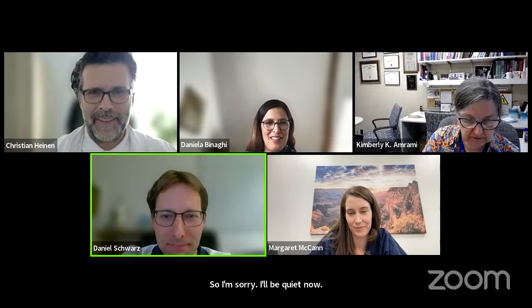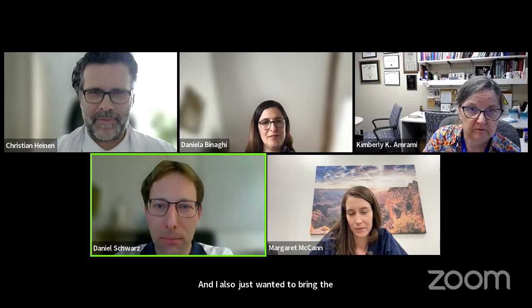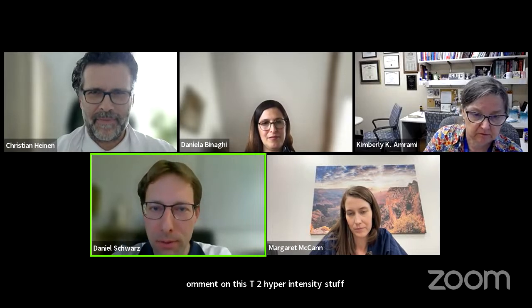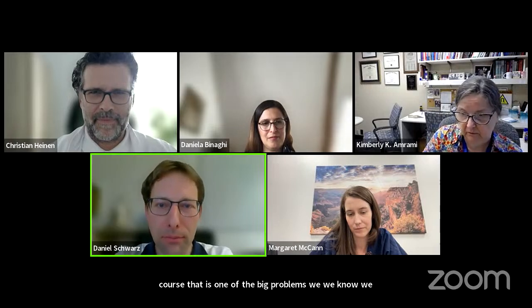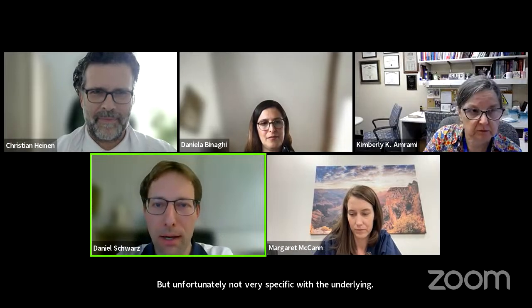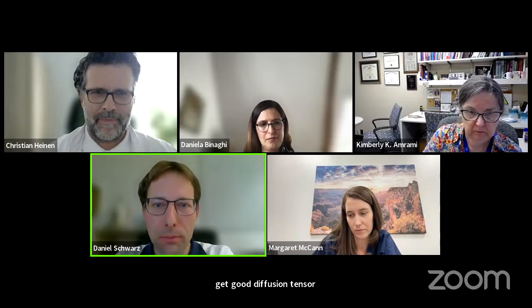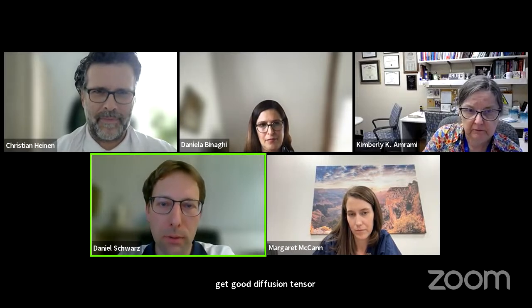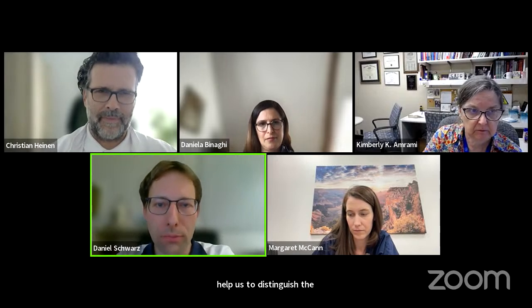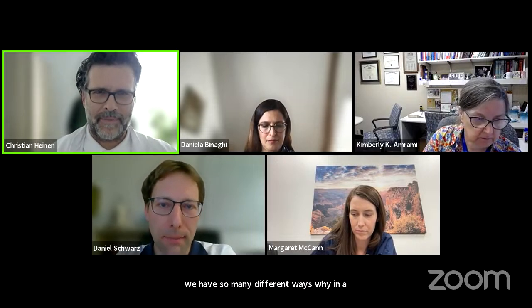Sorry. Daniel, please go ahead. I also just wanted to briefly comment on this T2 hyperintensity, because of course that is one of the big problems. We know we are extremely sensitive, but unfortunately not very specific regarding the underlying pathology. I'm really of the opinion that good diffusion tensor imaging will probably help us distinguish the underlying architecture of the nerve, because there are so many different reasons why a nerve can look bright. T2 alone is just not enough.